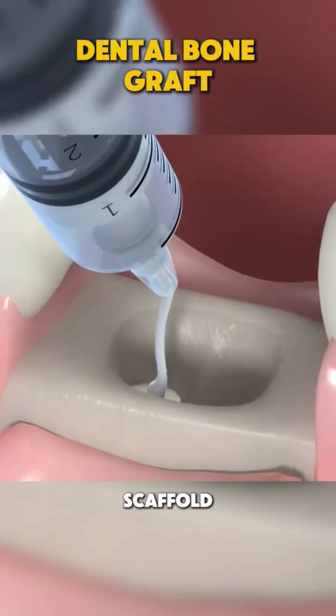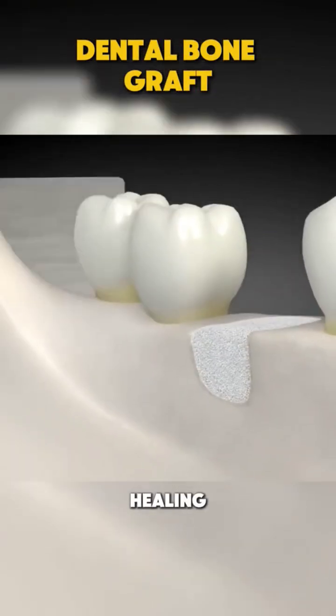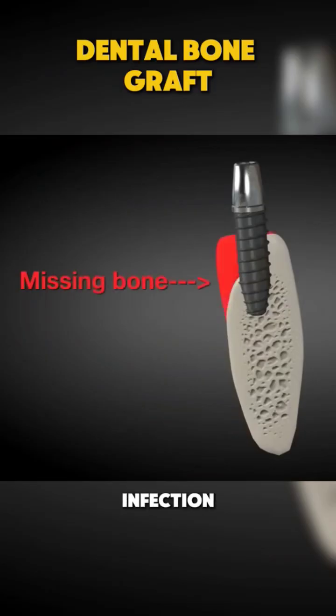This acts as a scaffold for new bone to grow. To protect the graft and encourage healing, a special membrane or covering is applied. This helps prevent infection and ensures the bone grows in the right spot.